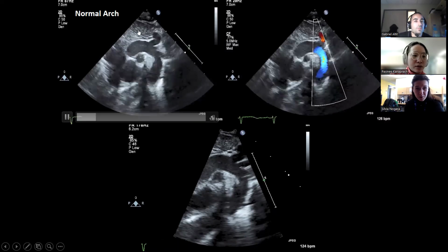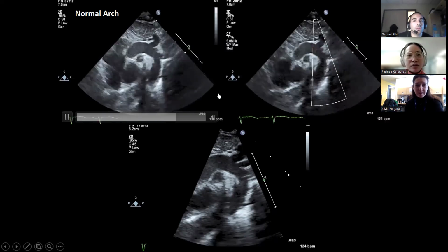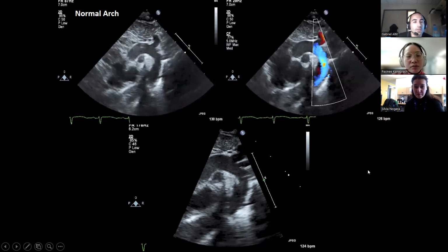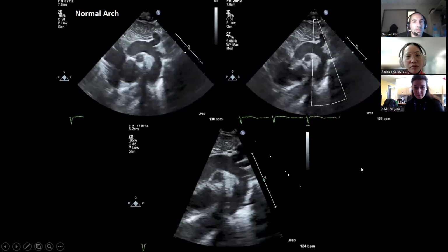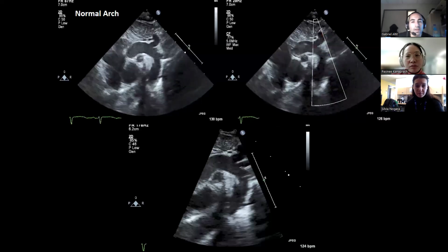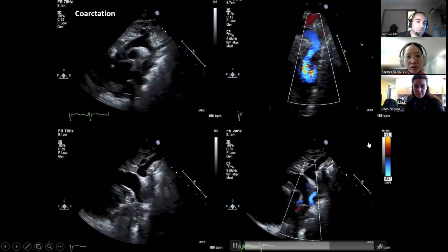What's this? Thymus. This is the thymus. Yes, exactly. So it's good to know that you have a thymus. It doesn't rule out DiGeorge anomalies, but if you have it, it's a good sign. Versus if you don't have it, then it points towards a DiGeorge if you also have a cardiac defect. But you can have DiGeorge and a thymus, so you have to be careful.